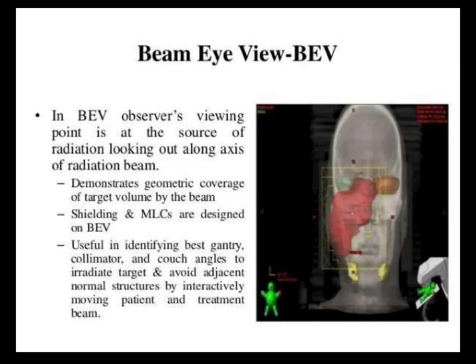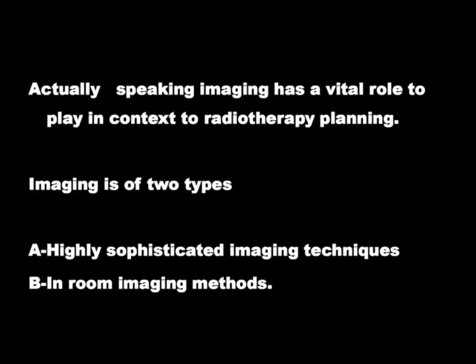this is the diagram where we have plotted all the tumors serially, not leaving any slice in between, also taking a margin, and then creating a volume of data, and then DRR images are created. And nowadays it is very simplified because of the advanced treatment planning systems we have. So after that, the DRR images, I told you how to create DRR images.